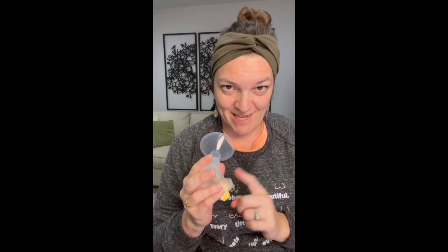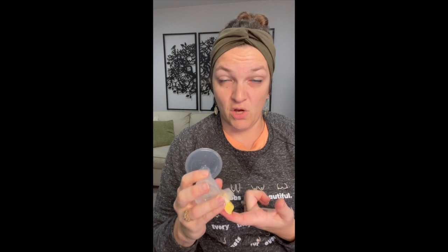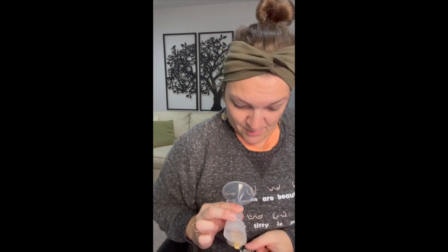This will give you the best suction to create negative pressure inside this flange every time that pump pulls, to make sure that the valve is correctly closing, creating enough pressure inside this closed space to move your nipple and move milk. If you have the pump membrane facing your body and you're leaning back, gravity may actually pull that white valve down and not get you good suction. So if you have the flange on and are noticing that you're not getting as much milk, or you need to turn it up higher, or you're not seeing your nipple move like normal, it may be because gravity is pulling that down.